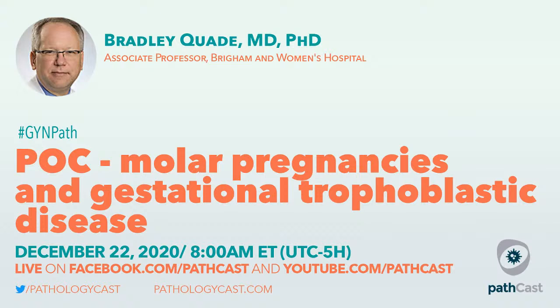Because of that, I think the antibody works pretty well. Drew Roberts, my counterpart over at the MGH, is a little more wishy-washy about it. When we set up the stains for the study for the in situ hybridization, we set it up over there, so she has a little more ready access to it. And Drew thinks about it as screening plus definitive test.